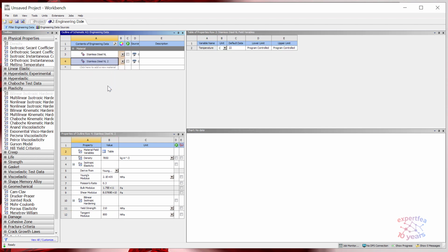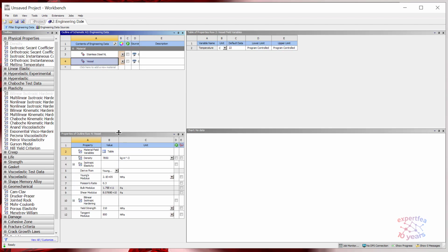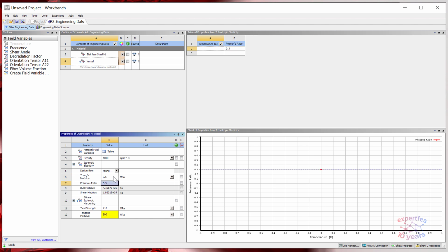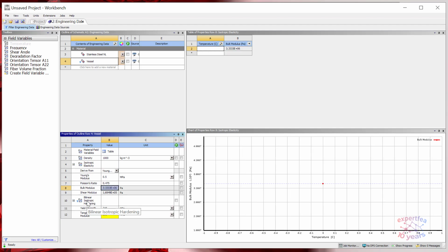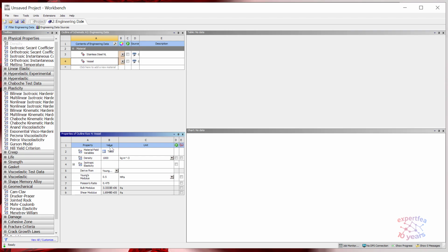Let's duplicate it and create the material for the blood vessel. We don't know now which one it is, artery, vein, capillary. It's not important for the moment. So let's define here 1000 kilogram per cubic meter. Young modulus 0.5, Poisson ratio 0.475. Let's delete bilinear isotropic hardening because we don't take into account plasticity here. In a way, this is kind of a simply defined hyperelastic model, let's say.